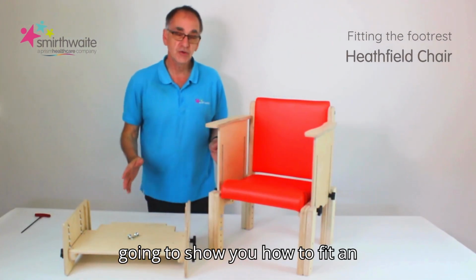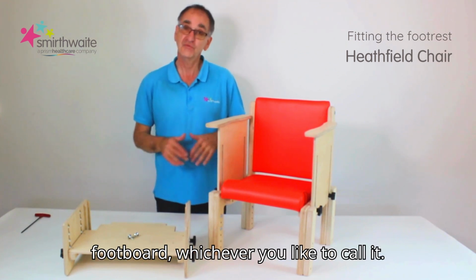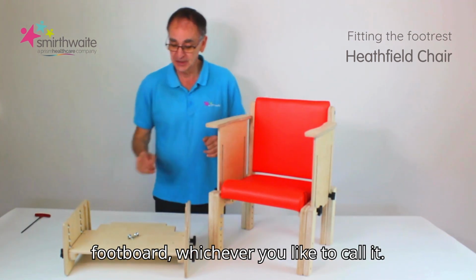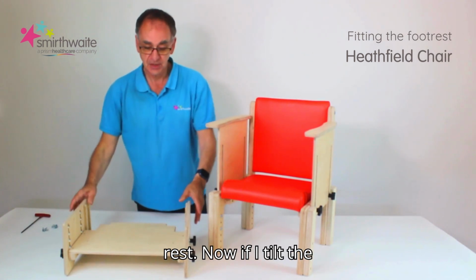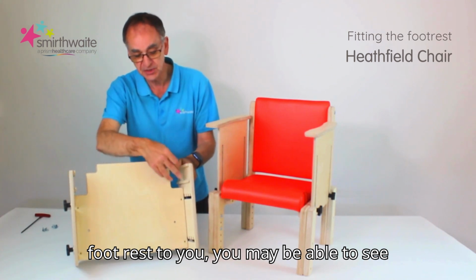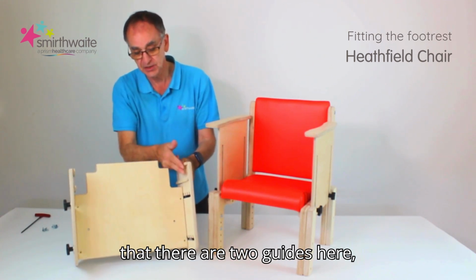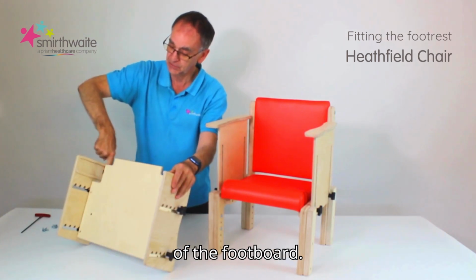So now I'm going to show you how to fit an adjustable footrest, or footboard, whichever you like to call it. And here is the footrest. Now, if I tilt the footrest to you, you may be able to see that there are 2 guides here, or 2 channels, if you like, at the back of the footboard.